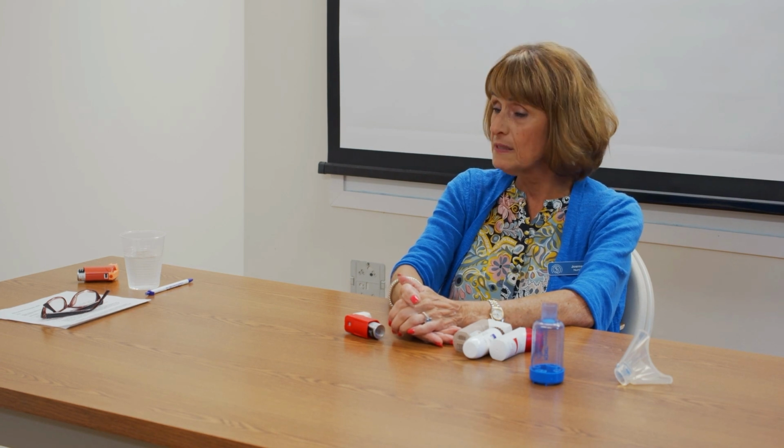A rescue inhaler is used when your child is having increased asthma symptoms such as wheezing, shortness of breath, or coughing. It's important to know that you shouldn't be using this inhaler more frequently than every 4 hours. Sometimes we do have a nighttime asthma action plan, and sometimes you may have to use it more for more severe symptoms. However, if your child does need to use their rescue inhaler 4 or more times a day, you should be calling the office to possibly set up an appointment because they may not be in good control.